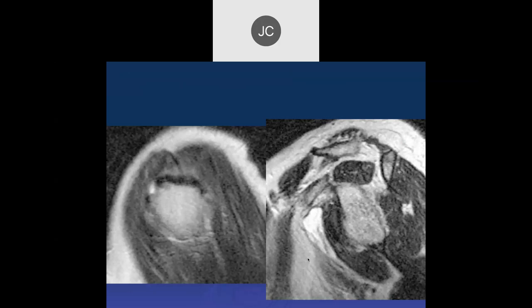We have axial and sagittal views — both sagittals actually. There's a focus of increased signal in the supraspinatus, indicating a tear at the anterior insertion, which is a common location. There's also a fluid collection — a bursal fluid collection anterior to the subscapularis. If we were more superior, it'd be the subscapularis recess, but this is the subcoracoid bursa.